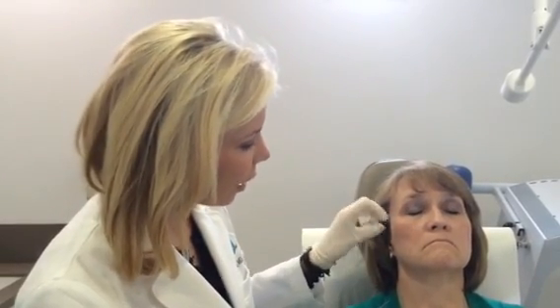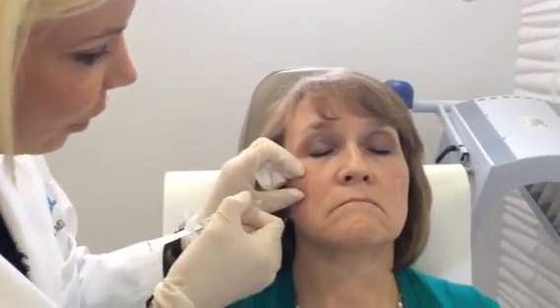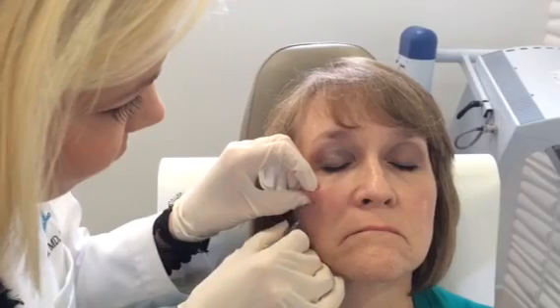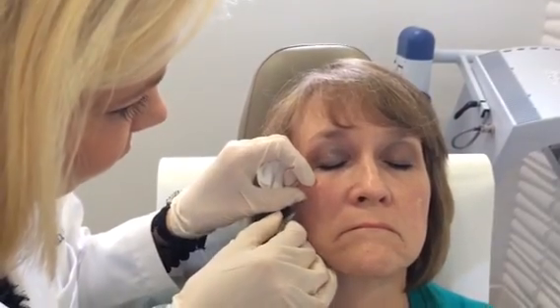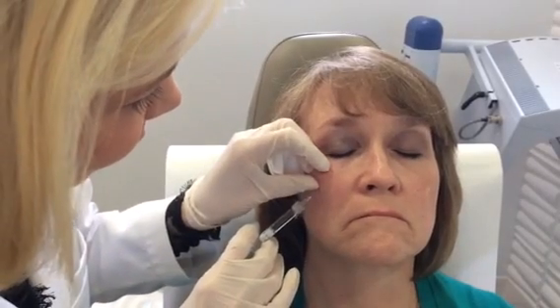So I'm going to get started. You're going to feel me pinching on the cheek. With the little entry point, and this is often the hardest part of actually doing the filler process, is getting in there and getting down to the right plane. Perfect. And so I'm just going to advance the needle.